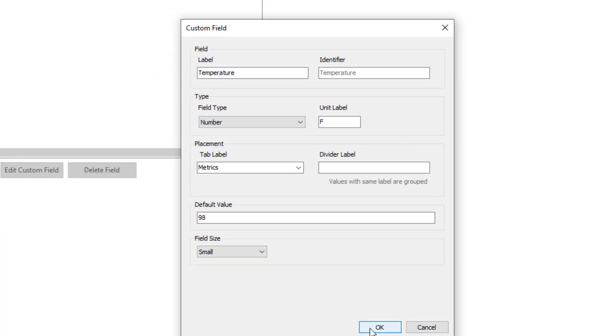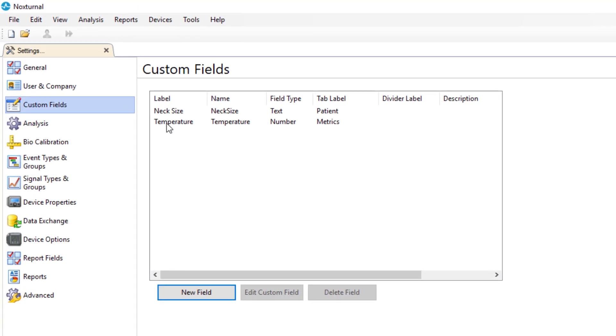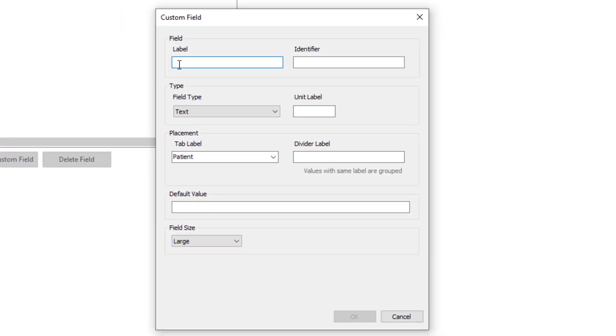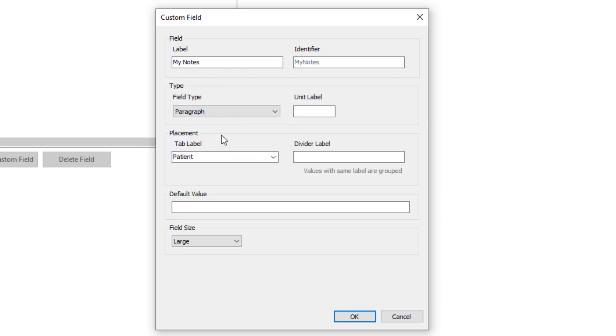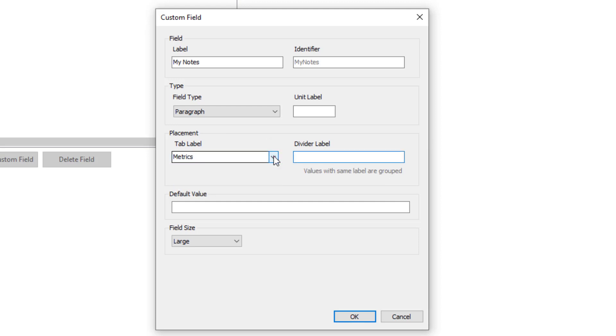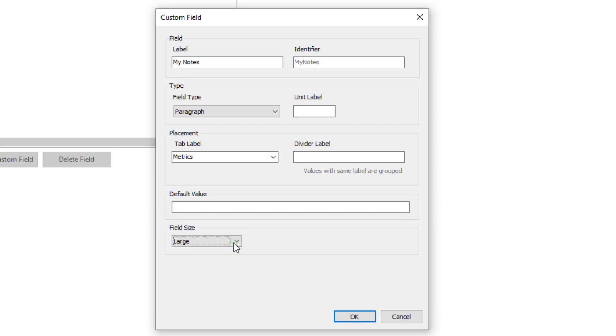Click OK and now we have a new custom field of temperature that will be under our metrics tab that we just created. Click again on new field. This time we'll create a label called my notes. We will make it a paragraph so that we can enter more information. We will put it again in our metrics tab and there will be no default value. For this one we'll make the field size large. This will give us room for more information to be entered. Click OK.